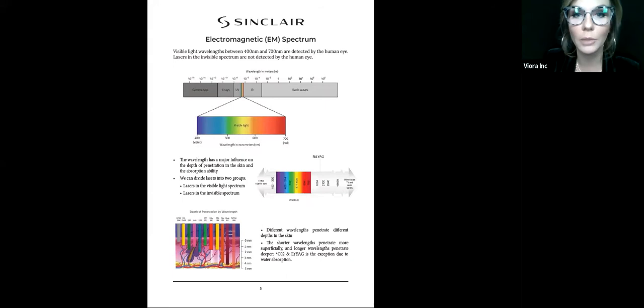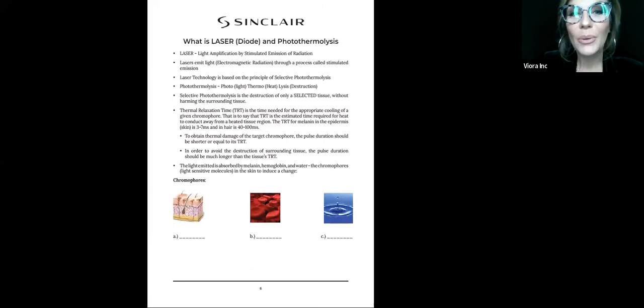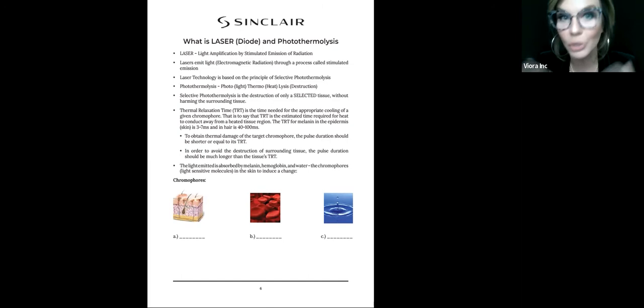Okay, so what is a laser? What does it stand for? So laser stands for light amplification by stimulated emission of radiation. Very long. And really it's a light-based technology, and a laser is light. And then that light transfers into heat. And if we can get enough heat, then we get coagulation and necrosis of whatever our target is. Death to the hair follicle or death to pigment, if that's what we're treating.